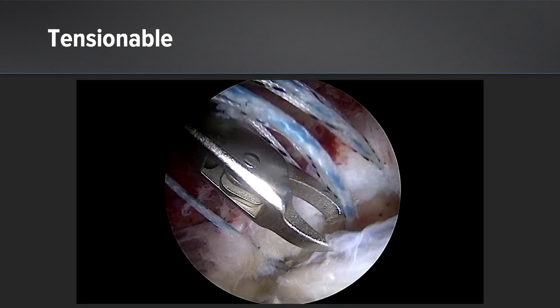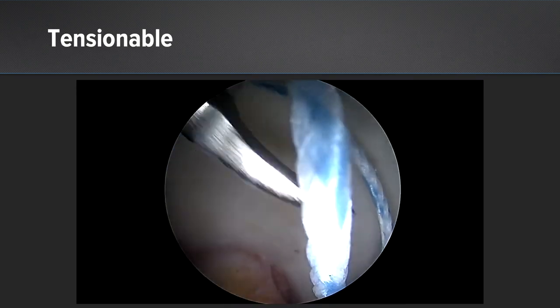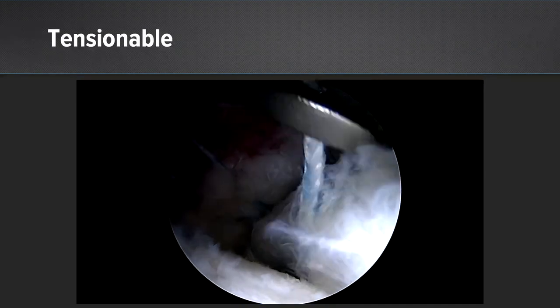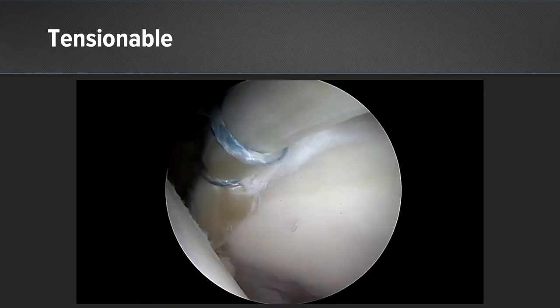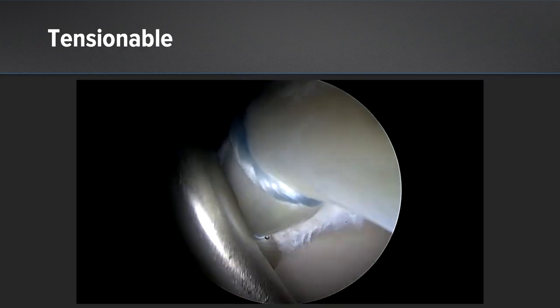This is a simple example of how it's a very tensionable anchor, and so we've inserted all of our anchors and passed our graft and secured it anteriorly. And as we pass the sutures, we're able to go back and tension the prior anchor before. So as we pass it around here, you can see that we've tensioned and cinched this down, securing the labral graft to the edge. The prior one is kept intact so that we can go back and tension it again.